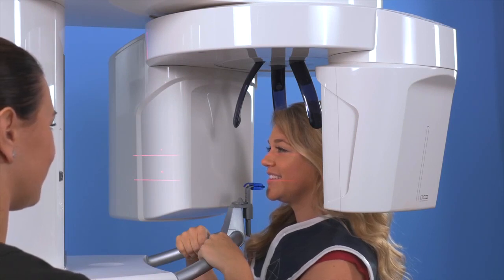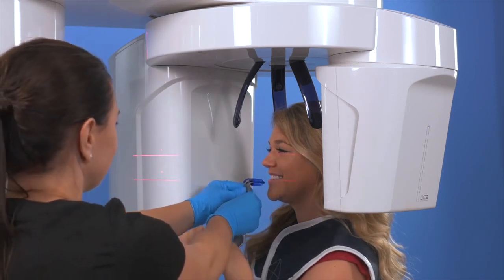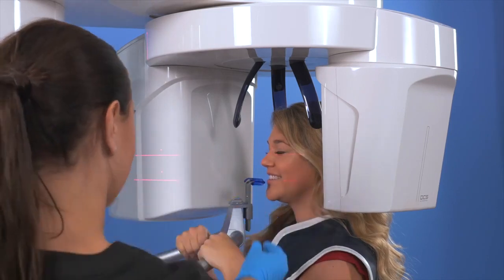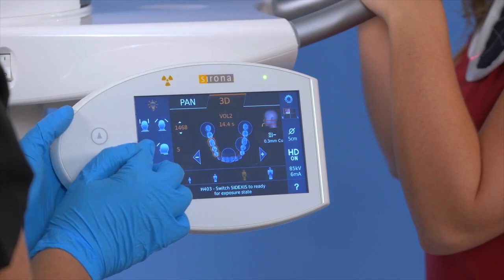We will then slide the bite stick to meet the patient's smile. Lock the bite stick into position and have the patient bite into the grooves of the bite stick. We will then close the forehead and temple supports.